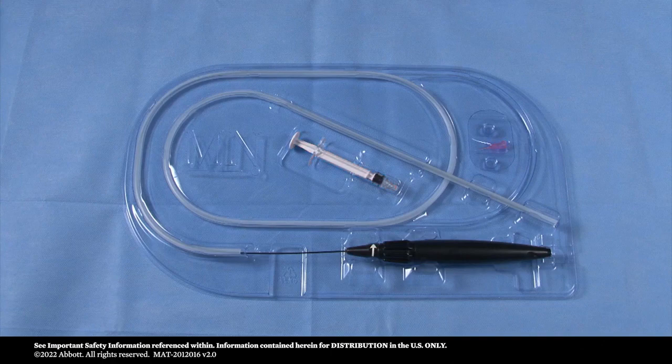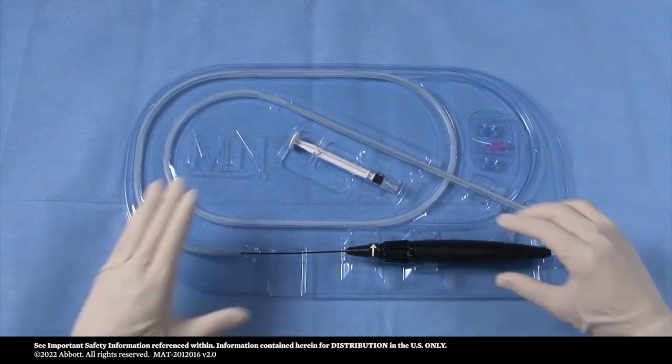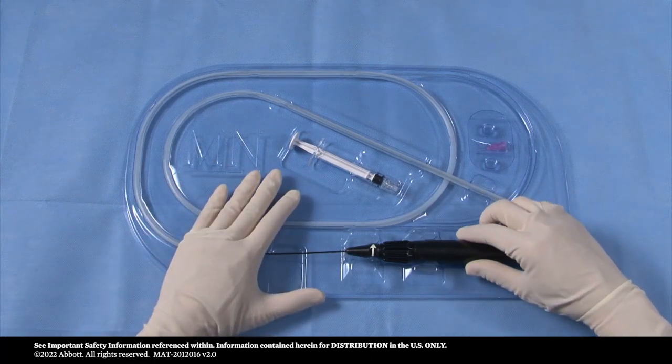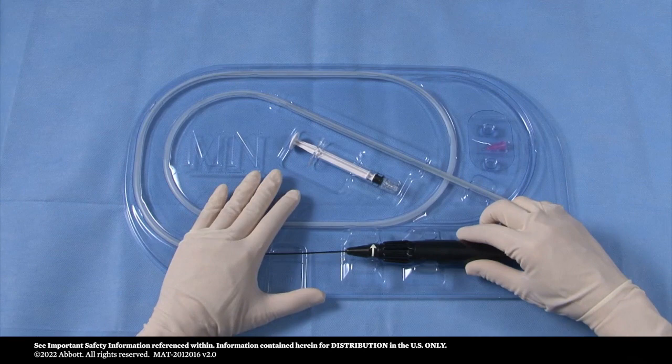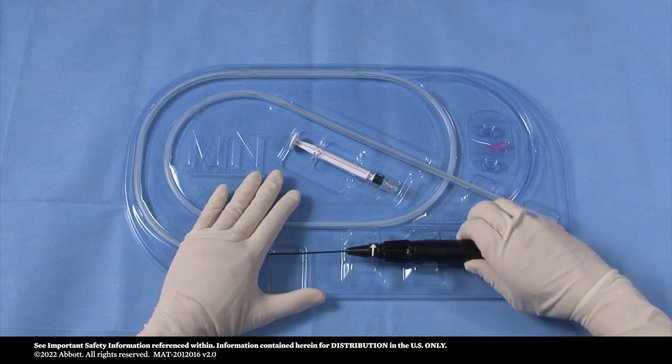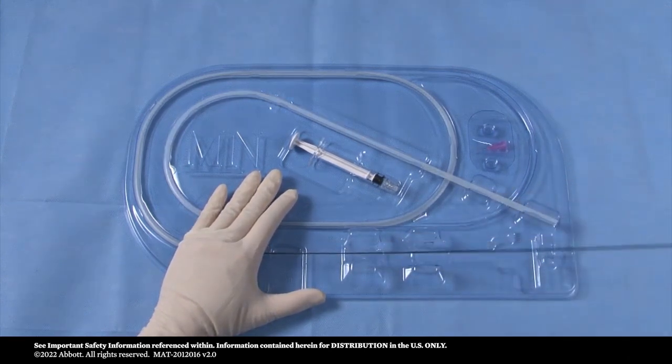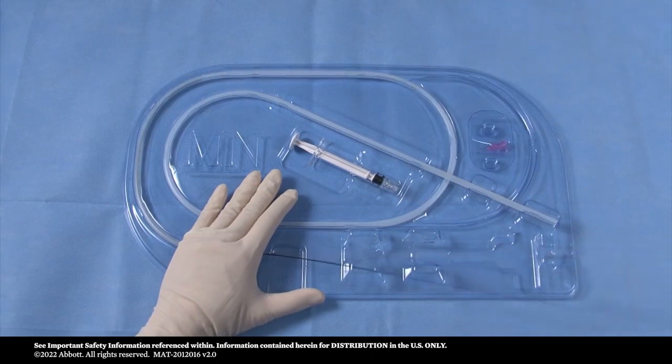To prepare the Exact Carotid Stent for use, remove the device from its protective hoop by grasping the handle in the position shown. Lift it up to release it from the tray and pull the device gently out of the hoop.